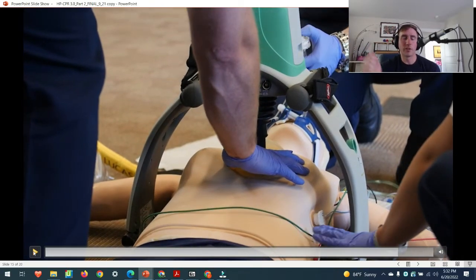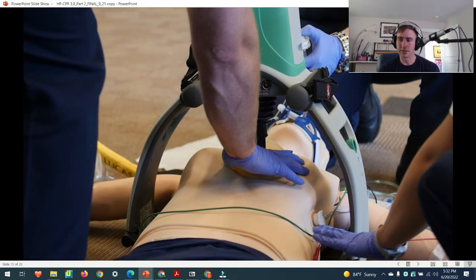So I think that's a really inefficient way of placing the device. And at our resuscitation academy, Jonathan Larson, who pretty much coined pit crew CPR, when they first got the Lucas devices, their survival rates decreased. So they got rid of them.